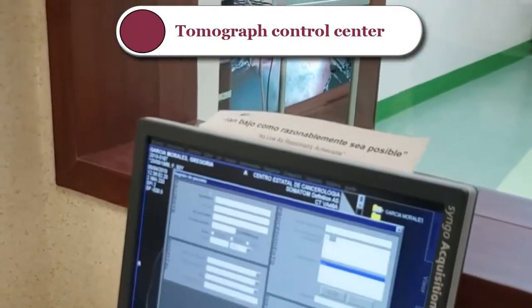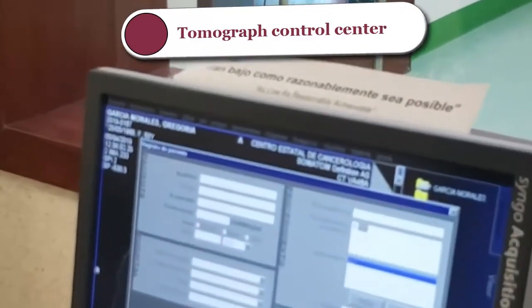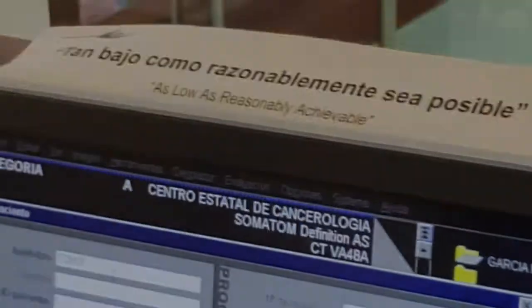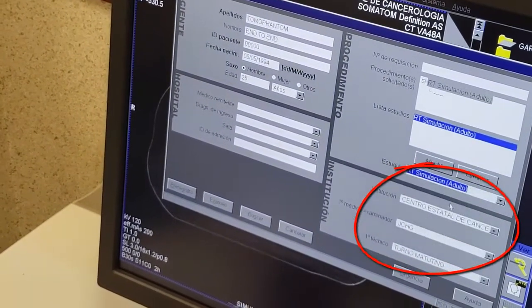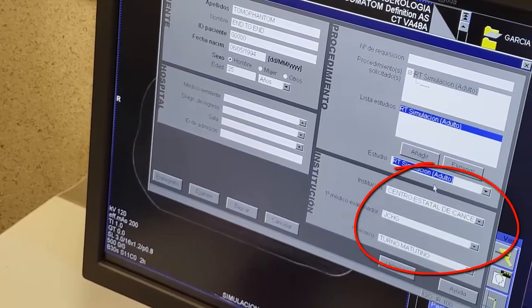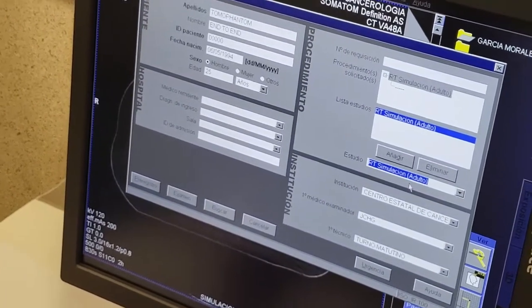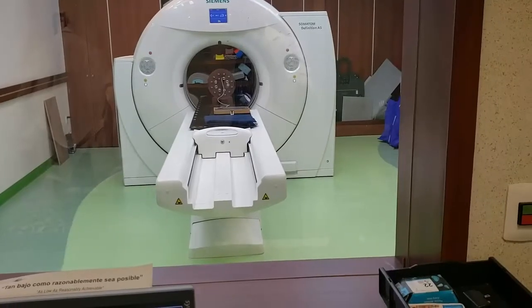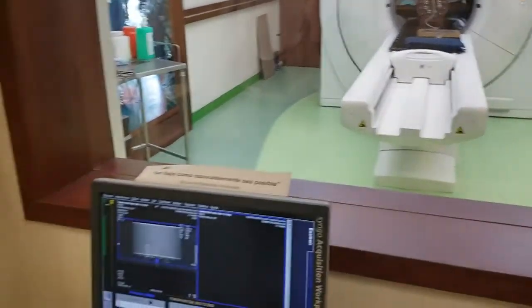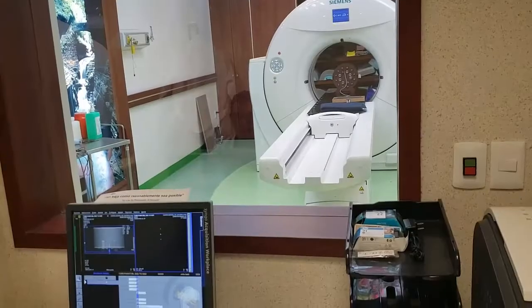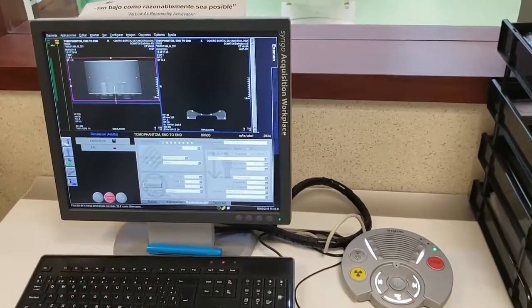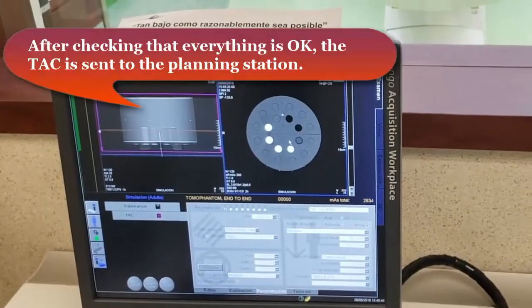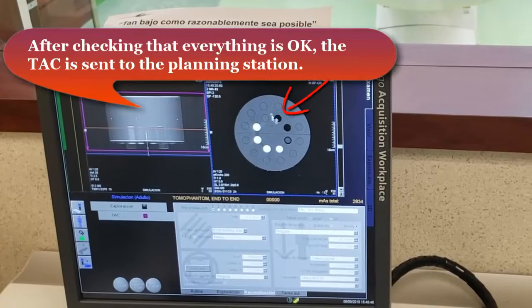We are now in the tomograph control center. We'll add our patient, registered last name: tomophantom, and we'll place the radiotherapy protocol we use for all of our patients, where the milliampere is already defined, as well as our kilovolts that will be used, and we engage. It now finished scanning. We reconstruct. Everything is fine. We check the chamber — here is our ionization chamber.